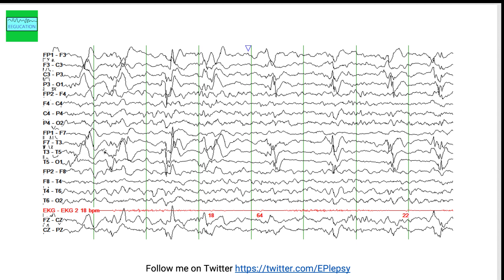Looking at this next EEG, the most striking findings are sharp wave discharges occurring every one to one-and-a-half seconds, seen in the left parasagittal region as well as the left temporal head region. These were previously called PLEDs, now called periodic lateralized discharges. When you see this pattern, the person is at high risk of having seizures. You can see this pattern with herpes encephalitis, subacute structural destructive lesions like a brain abscess, acute or subacute stroke, and in a postictal state. Look up the causes of periodic lateralized discharges — this is a high-yield question for neurology and EEG exams.